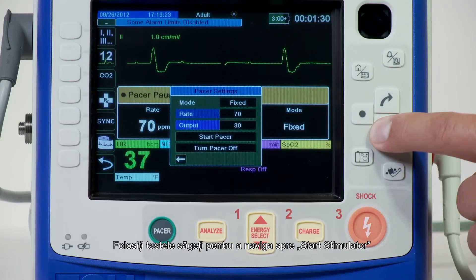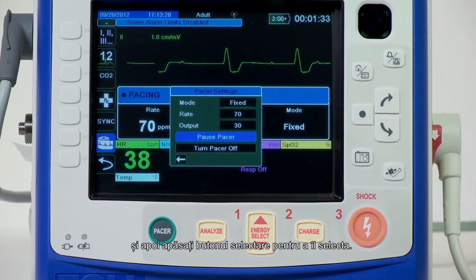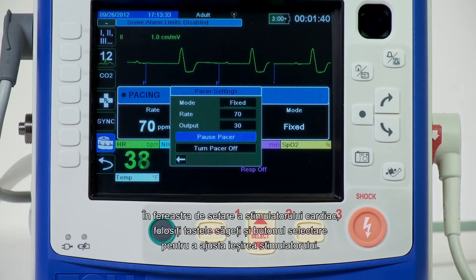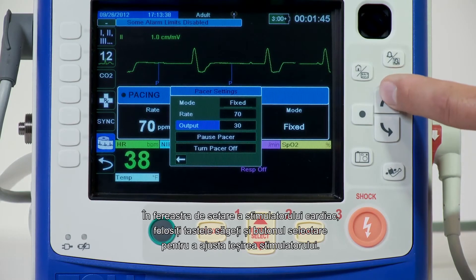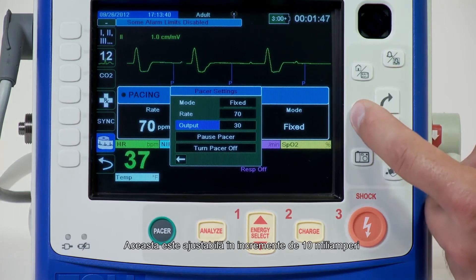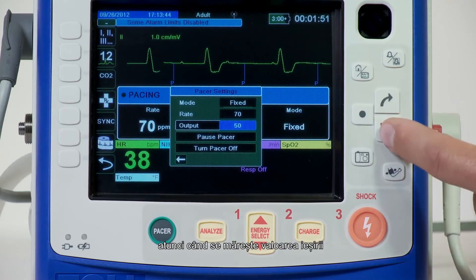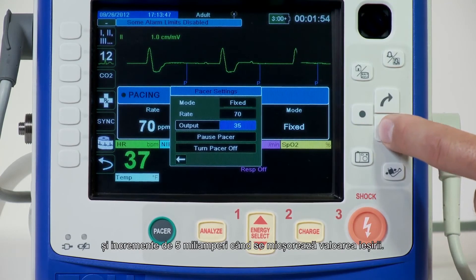Use the arrow keys to navigate to start pacer and then press the select button to select it. The pacing window displays behind the pacer settings window. In the pacer settings window, use the arrow key and the select button to adjust the pacer output. The pacer output is adjustable in 10 milliamp increments when increasing the output and in 5 milliamp increments when decreasing the output.